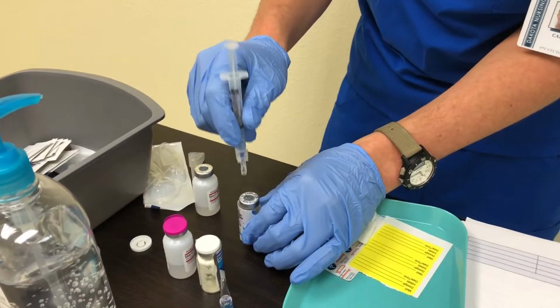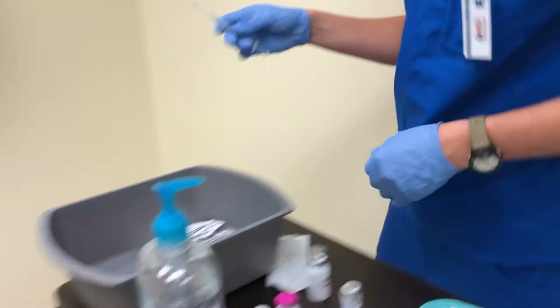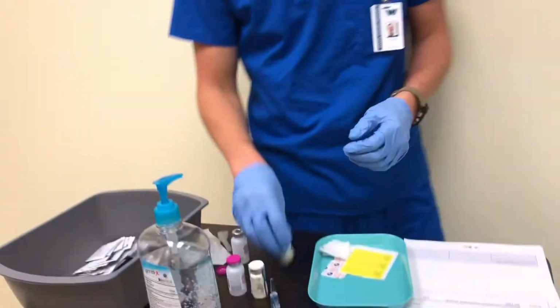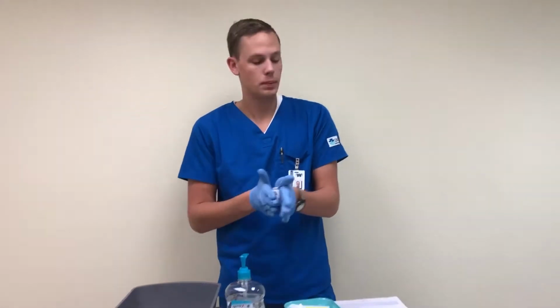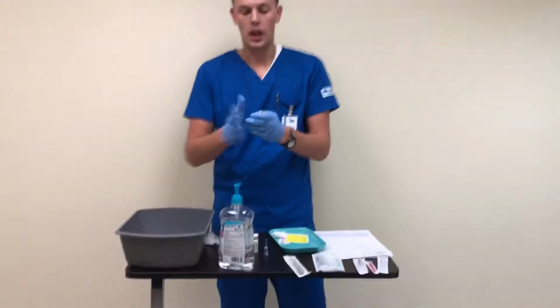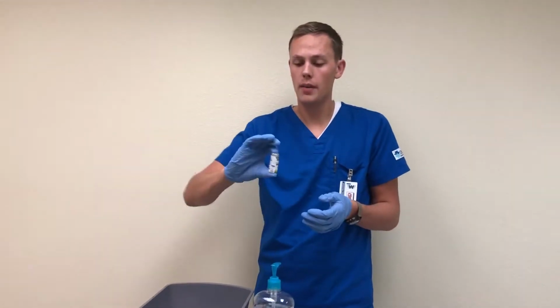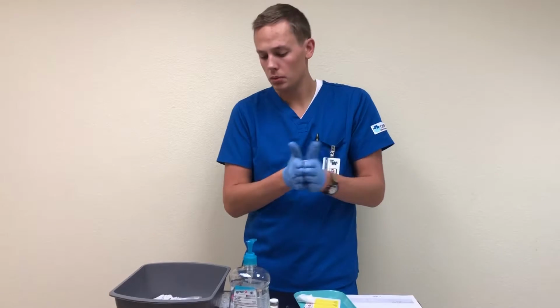And then I can pull this out and put on the safety lock and dispose of this. And then I'm just going to roll this around just to make sure the medication is mixed up. Making sure all the powder is dissolved and diluted. And give it a couple upside downs to make sure I get any medications that might be on the cap. Give it a few more rolls. Never want to shake it because that can create air bubbles.